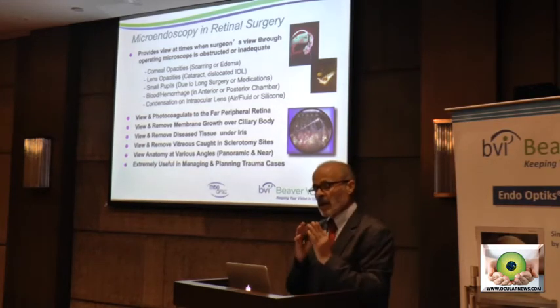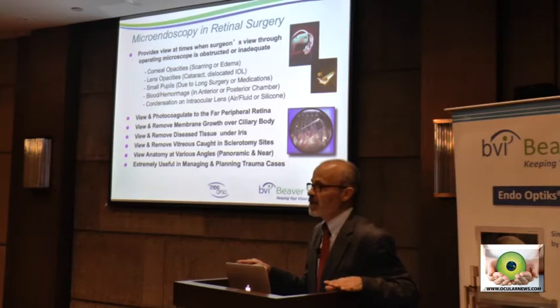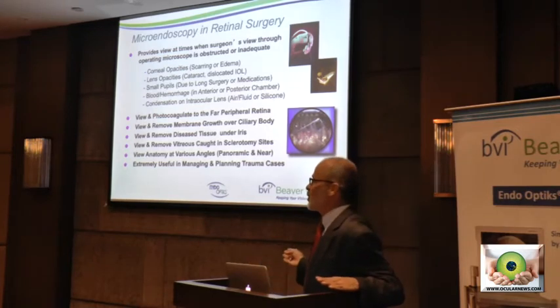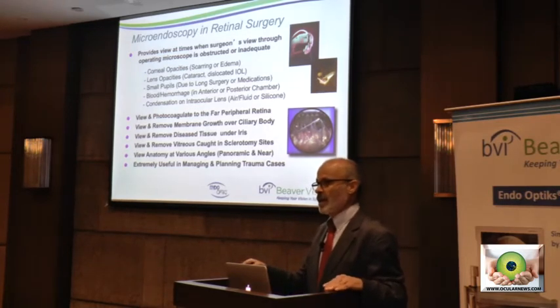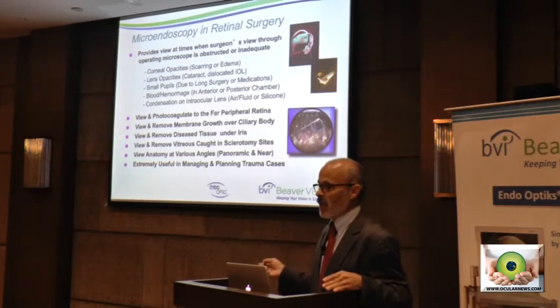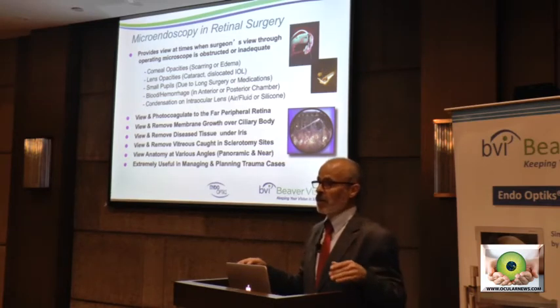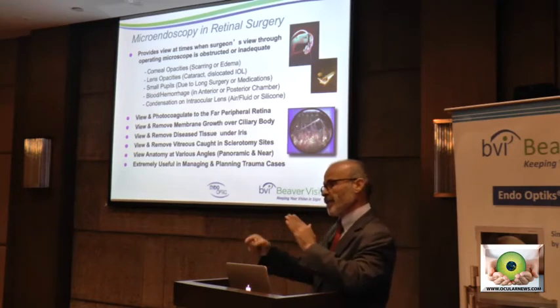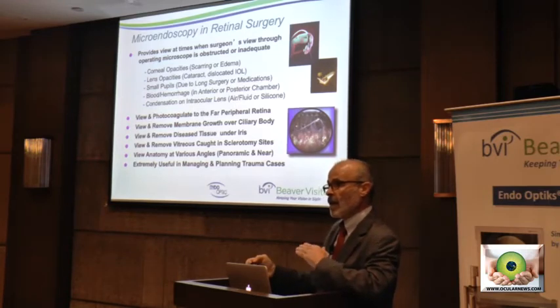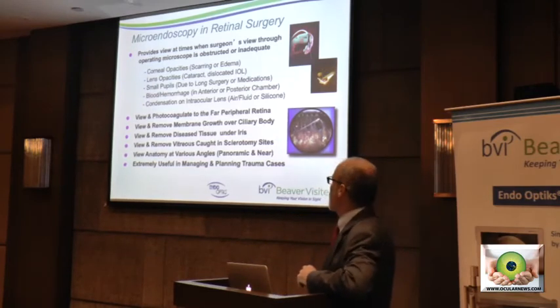A lot of retinologists at first were very hesitant to adopt the endoscope. They said, hey, I can see everything I need to see with my BIOM, with my wide field viewing device. We don't want to argue that the endoscopic view compares with the microscope view. No chance, of course. The beautiful stereo optics that you get via the microscope can't be duplicated in a fiber optic endoscope. But the additional views that the endoscope can afford you for things like an intraocular foreign body, being able to view that from both the top-down perspective of the microscope and the intraocular view, often allows you to plan a safer, higher quality procedure than you might if you had the top-down view only.